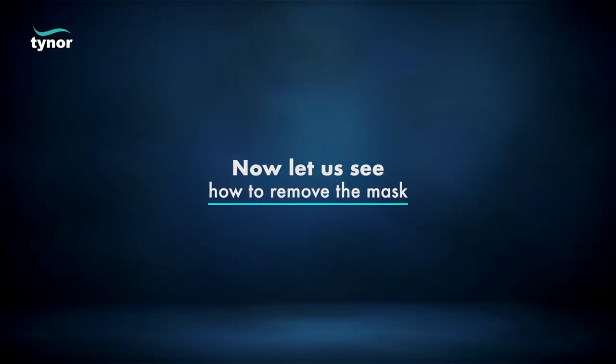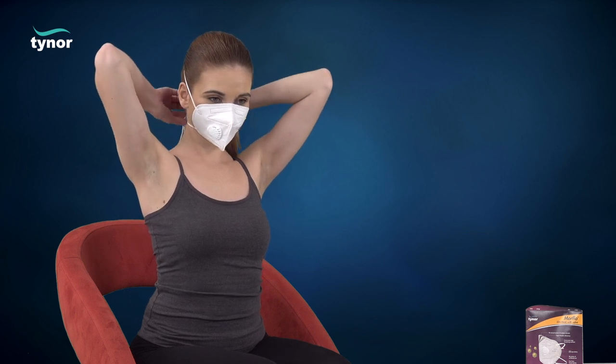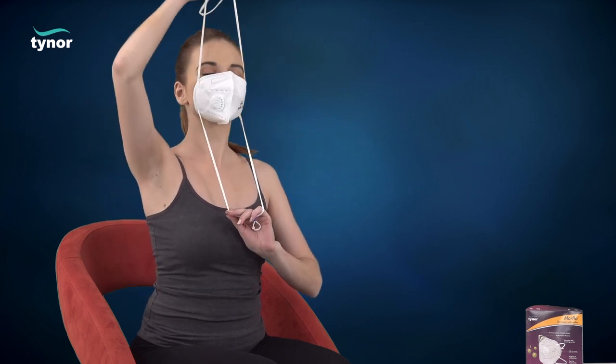Now let us see how to remove the mask. Sanitize your hands. Cup the mask in hand to maintain position on face. Pull out the bottom strap over the head. Still holding the mask in position, pull out the top strap over the head and remove the mask.